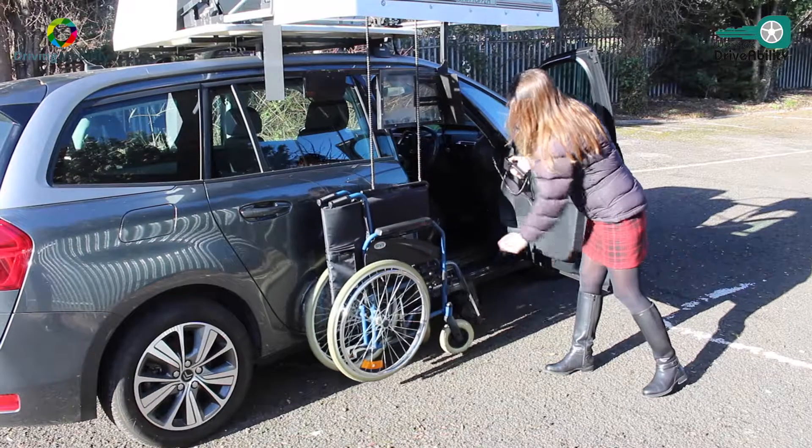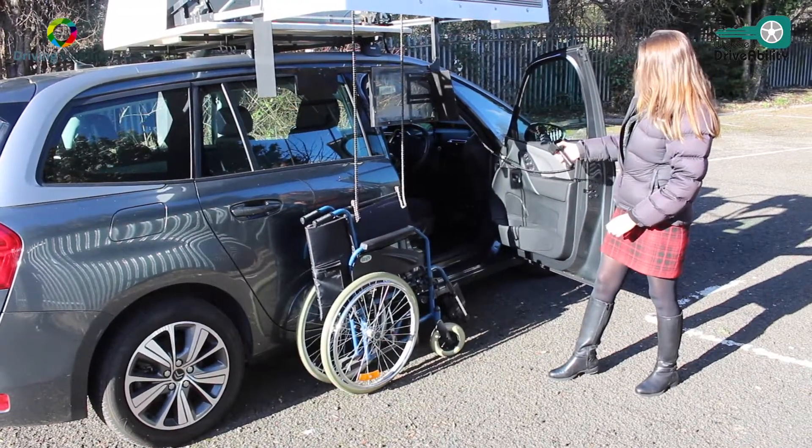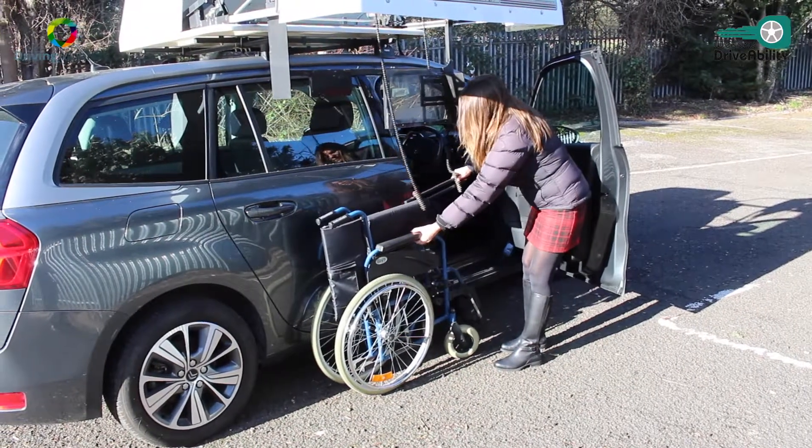Helping the wheelchair down there, and that's it — just released from its position. And the bar just slides out there.